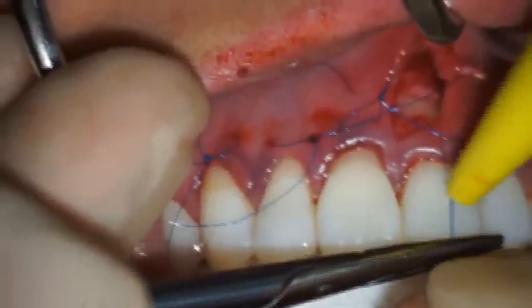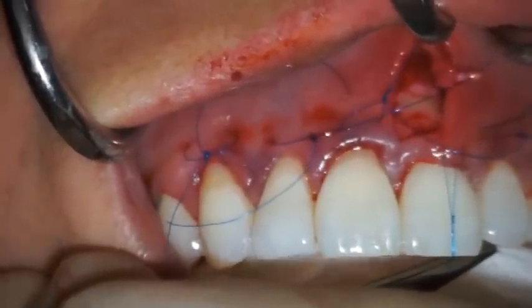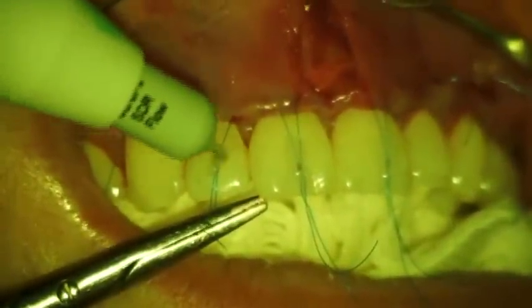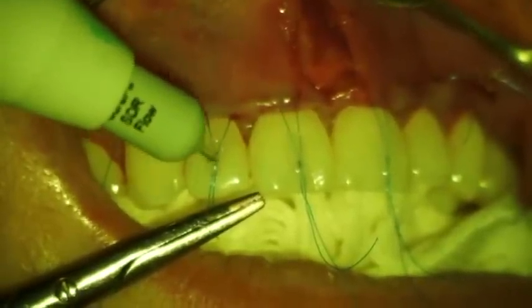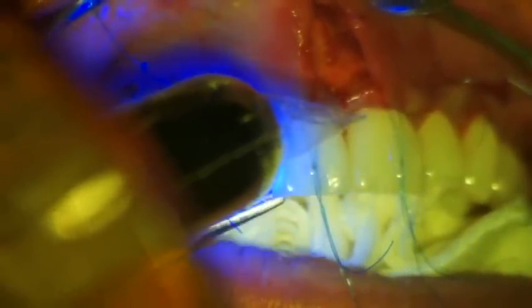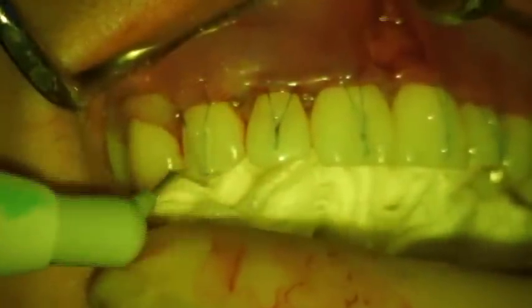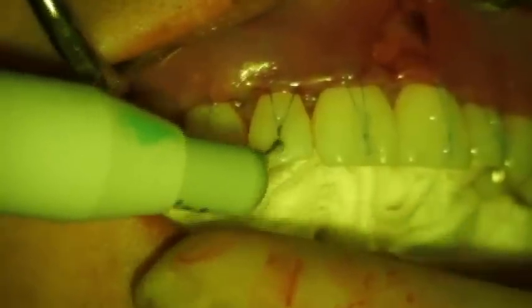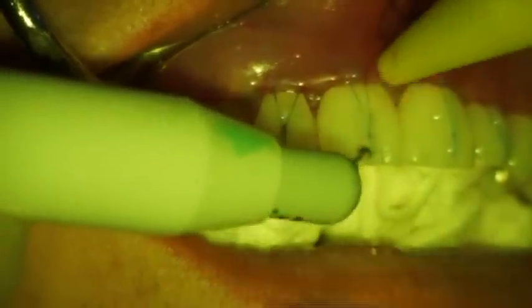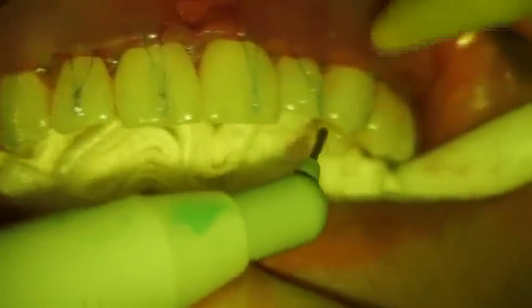The gingival margin is then coronally advanced with minimal tension beyond the CEJ to the most coronal level possible of the interproximal papillae. The polypropylene sutures are then secured to the facial aspect of each tooth by placing a small amount of flowable, light-cured composite over each suture knot, preventing apical migration of the gingival margin during early stages of healing. Without over-desiccating the tissues, teeth should be thoroughly dried prior to bonding. A small amount of additional composite is placed over the sharp edges of the suture knot. The bonded sutures can be removed after 3 weeks, or at the discretion of the clinician. Over time, the gingival margin will reposition itself at the level of the CEJ.